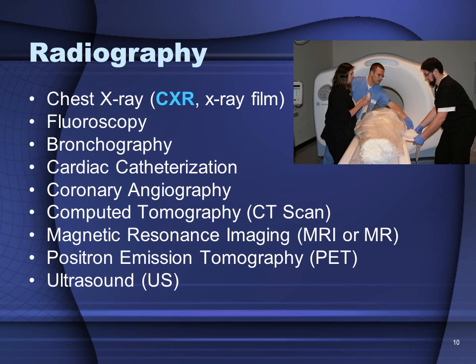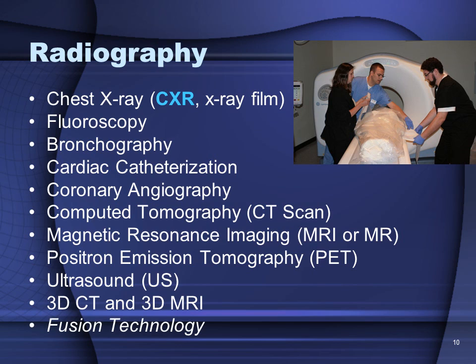Ultrasound. 3D computed tomography and 3D or three-dimensional MRI. And finally, fusion technology, where a high-resolution CT scan or MRI scan is combined with some other modality, either ultrasound or PET scan.